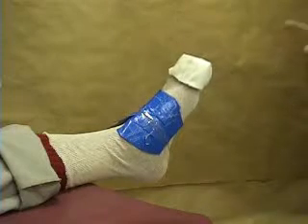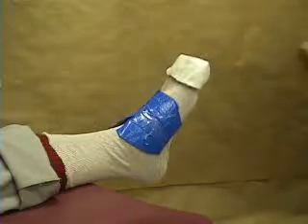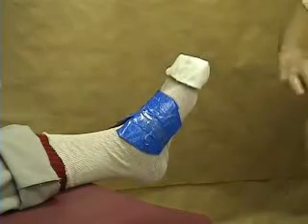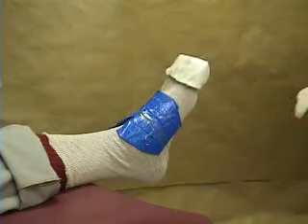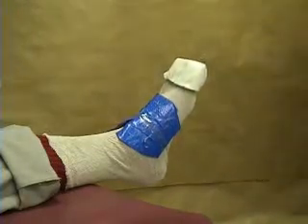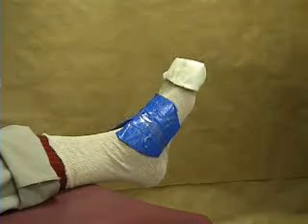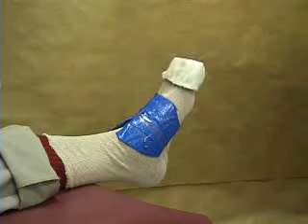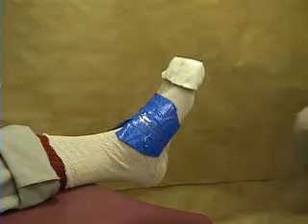Okay, so we're ready to put on the casting material now. In order to do that, you need to make sure that you've got some gloves on, just because it can be quite irritating to the skin. While the casting material sets, it becomes warm, so you might need to warn your subject that that will happen. Not uncomfortably warm.